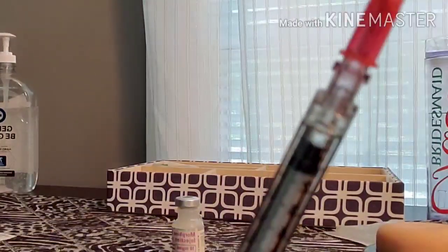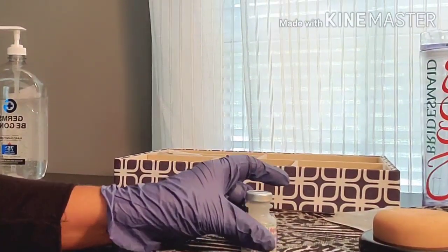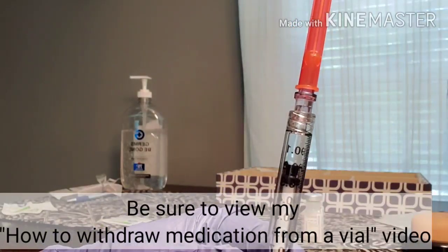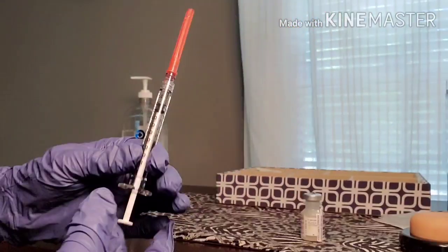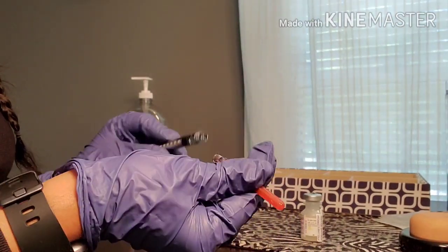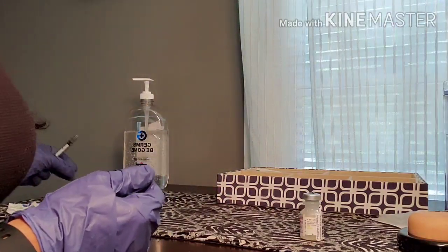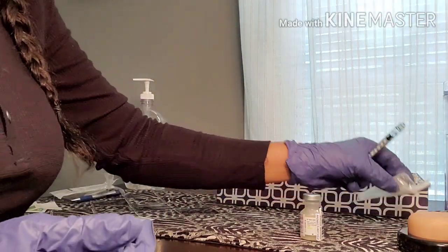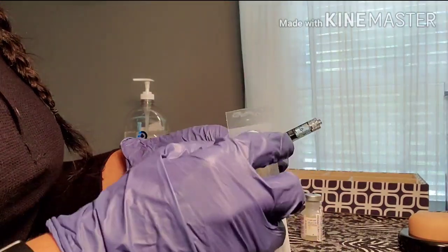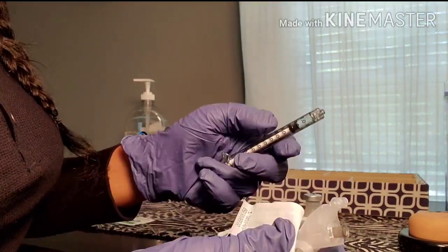I have my blunt needle on my one milliliter syringe. I've already cleaned my vial and allowed it to dry, and I draw up 0.2 mL — always reading at eye level. I no longer need the blunt needle, so I place it in the sharps container. Then I go ahead and attach the IM needle I want to use — my 22-gauge, one and a half inch — without setting the syringe down so it stays uncontaminated.